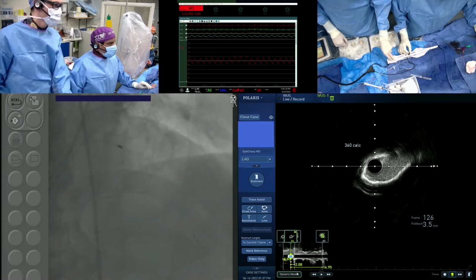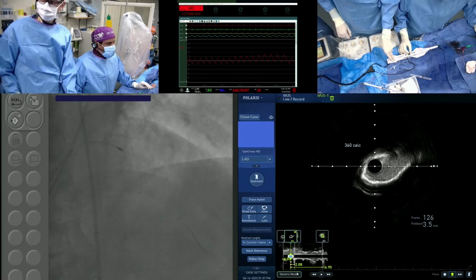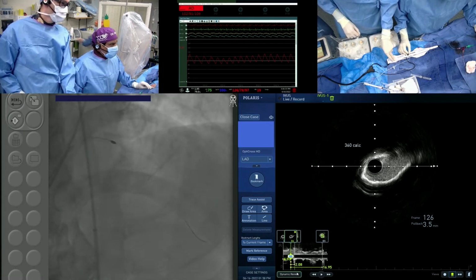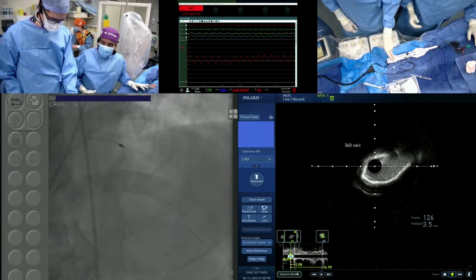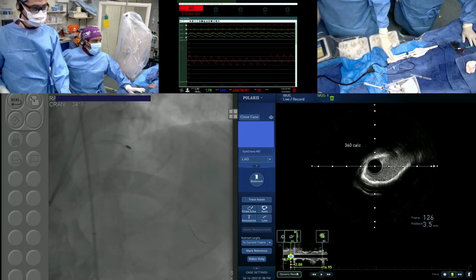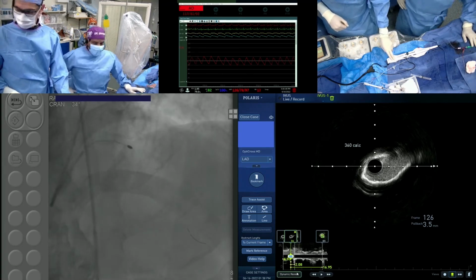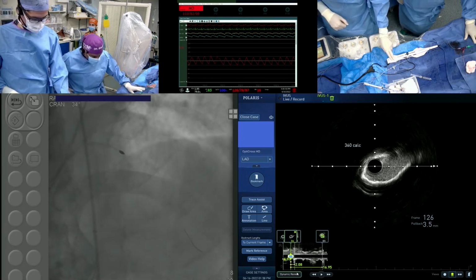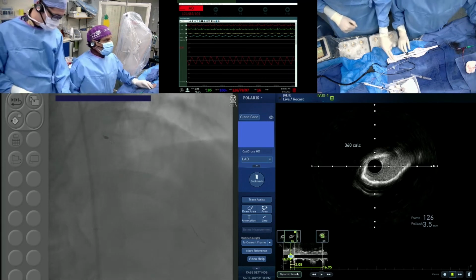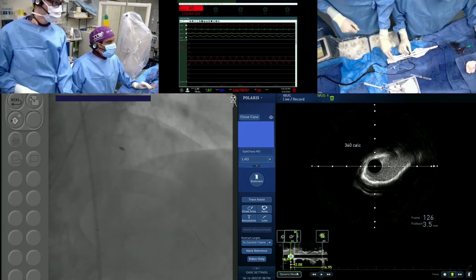Touch, come back. No, we did not cross yet, and the RPM, because of the angulation, went down to about 130. So we are going to upgrade our RPM to 150, 155. I know that one small randomized trial of 100 patients didn't show any difference between low or high speed, but we go with the low speed usually, 150. Good, 150, yeah.